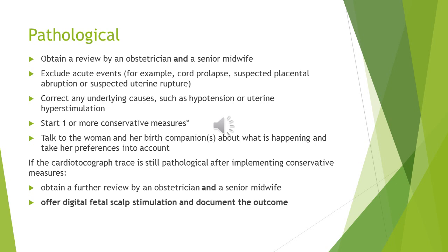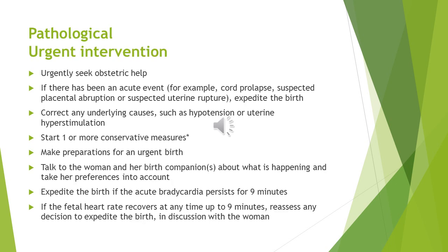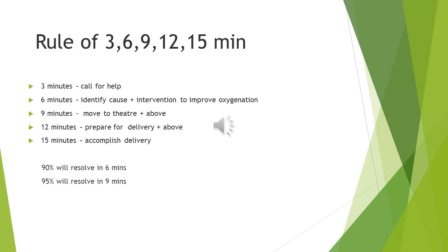However, if you had the fetal scalp stimulation and the fetus is not responding, no acceleration, this means the baby is not healthy. For CTG which requires urgent intervention, as said before, a bradycardia or a prolonged deceleration for more than 3 minutes. In this case, you need to seek urgent obstetric help. Again, exclude acute events. You have to correct any underlying cause and again start the conservative measures, but you have to make preparation for an urgent birth. Don't forget communication. If bradycardia persists for more than 9 minutes, the baby should come out, and then we'll go to the rule of 3, 6, 9, and 12.